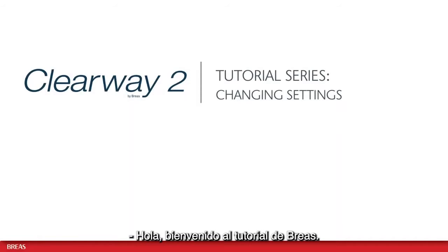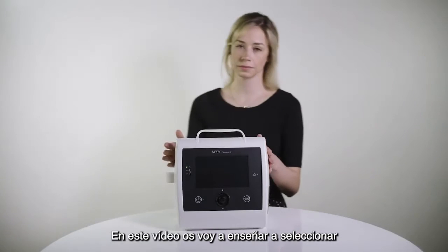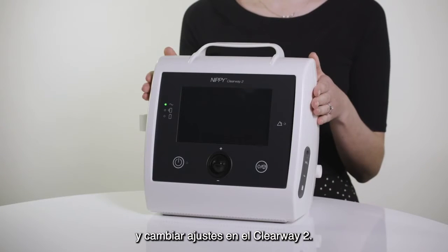Hello and welcome to the Breas tutorial series. In this video I will show you how to select and change settings on the Clearway 2.